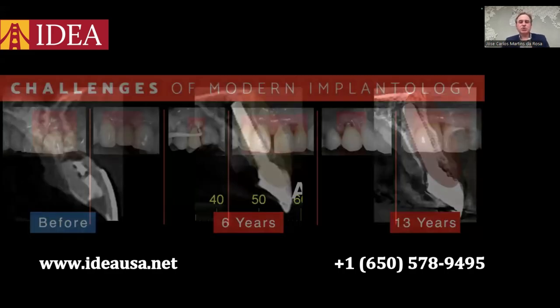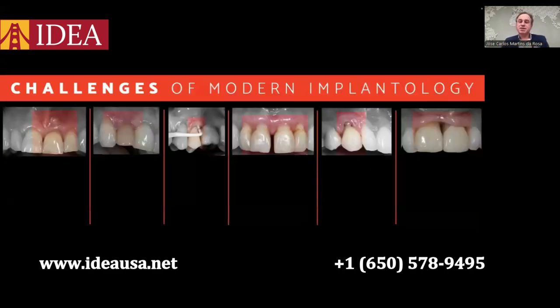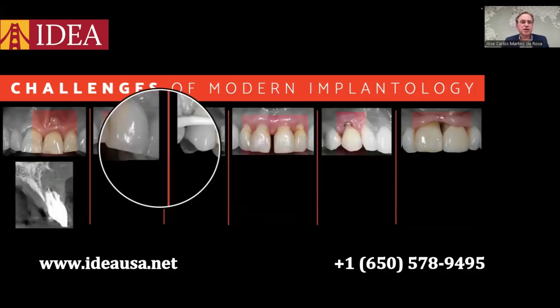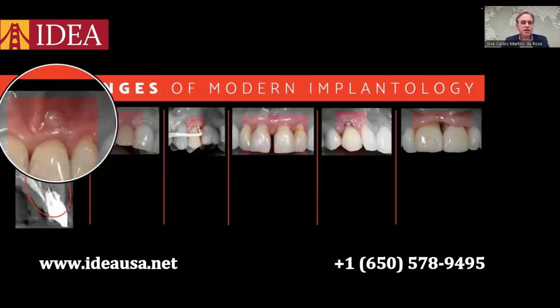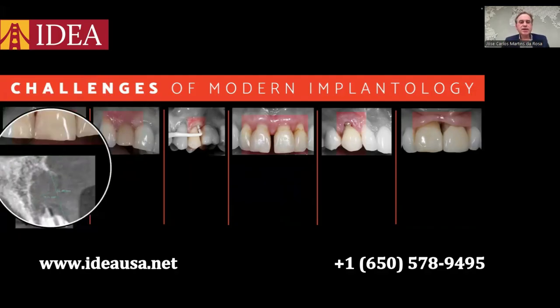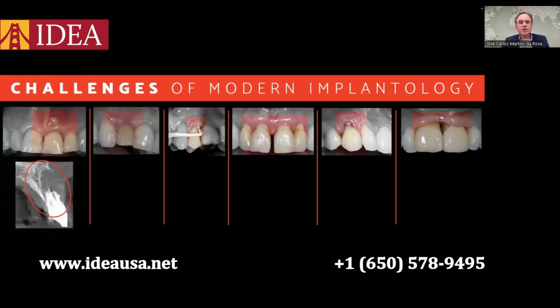Here, I would like to share with you some challenges that you may face in your daily practice. Let me explain one by one. The first one, we have a huge infection in the upper left central incisor and a huge lesion. It was missing the buccal wall completely. The second one, you have this lateral incisor condemned to be extracted.